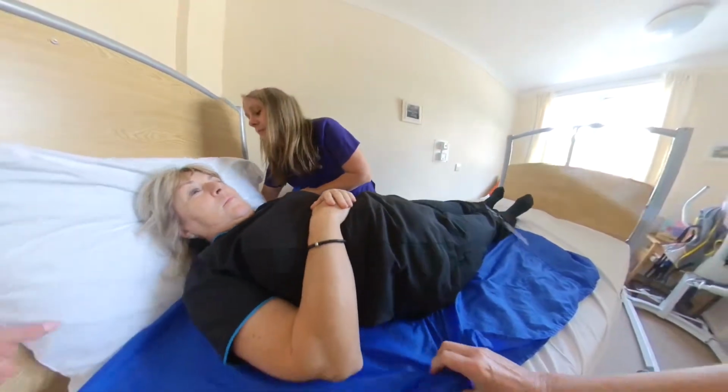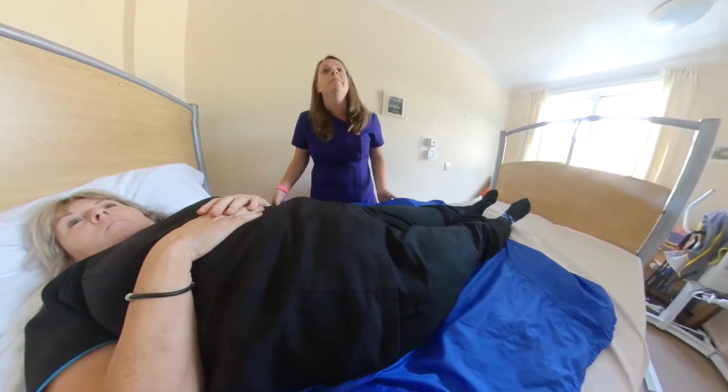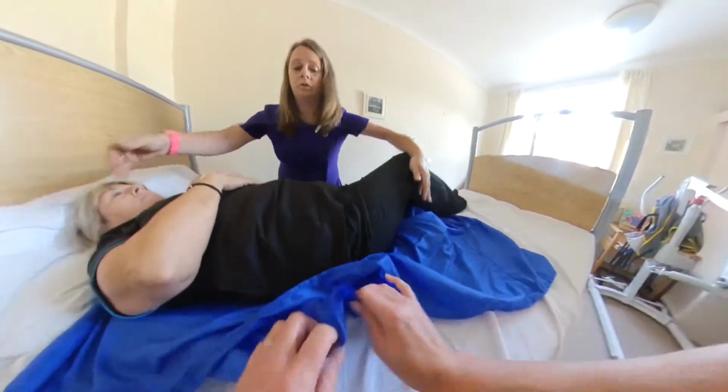Once in the correct position, roll the service user onto their side again and push the slide sheet through. Roll the service user onto their opposite side and then pull the remaining slide sheet out from underneath the service user, and then roll the service user onto their back.